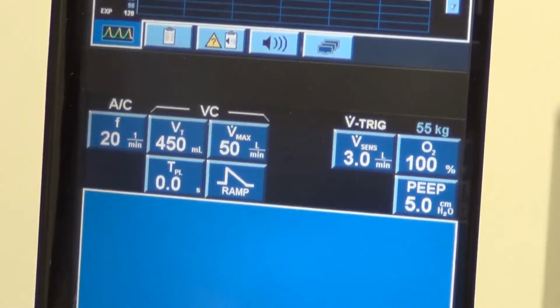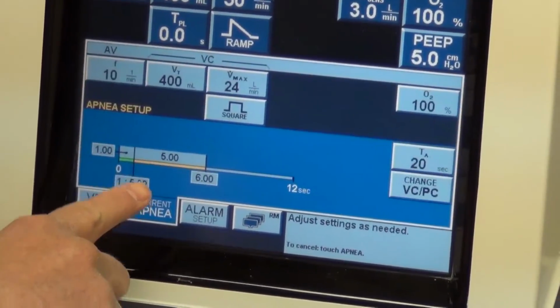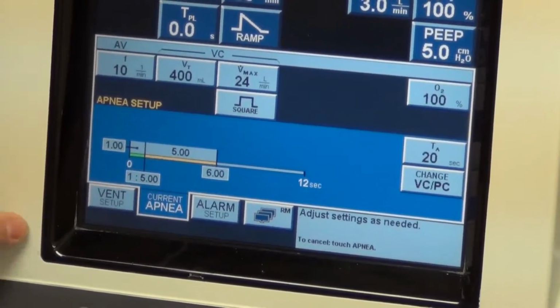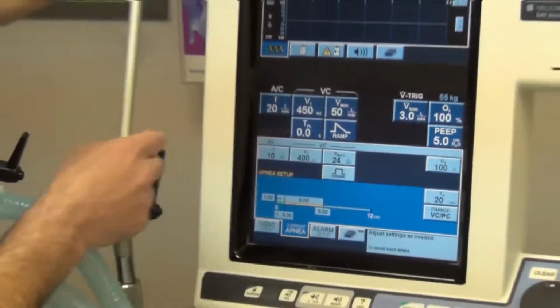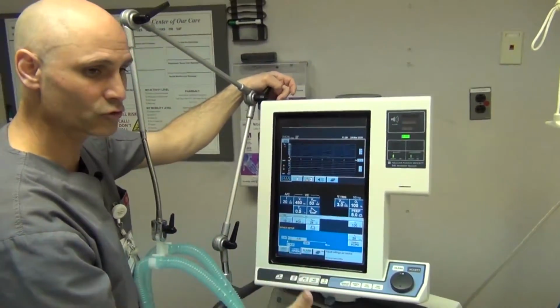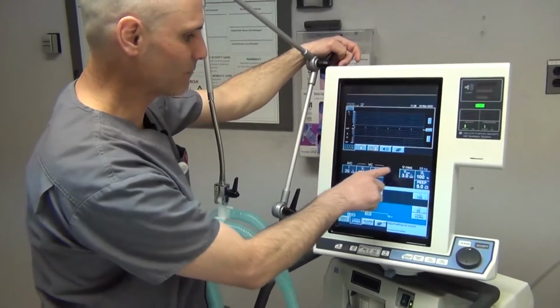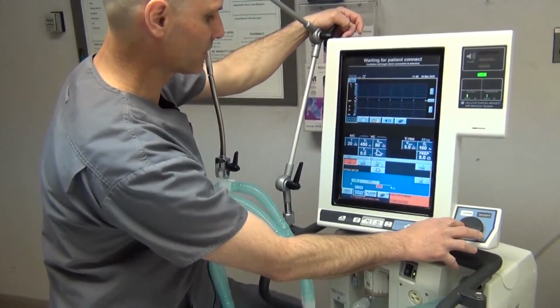So if you look at the menu at the bottom, we've already selected our modes. Next we want to set is current apnea mode. The current apnea mode is a backup. If this were to fail, the ventilator goes back to these settings. In this particular instance with assist control ventilation in volume control, we're going to use the same numbers we put at the top. For instance, we're going to put it to 20 just like above.